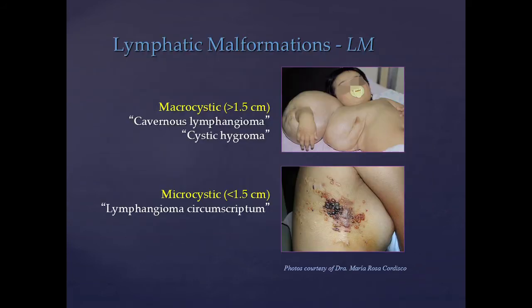So let's look at the macro versus microcystic. That's a convention that really is a sort of a size criterion of convenience. It's really for the people who are thinking about treating these by injection of a sclerosing agent. It's really a sort of a practical cutoff. Can I put a needle in, suck fluid out, and replace it with whatever agent I want to use? It's not microscopic and you can't see it, versus macroscopic. It's really sort of a more practical cutoff.